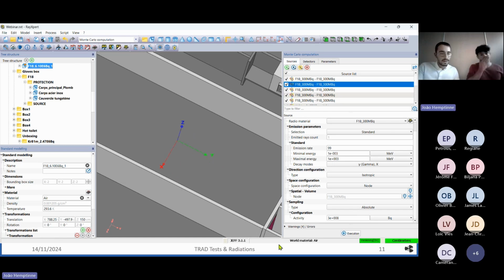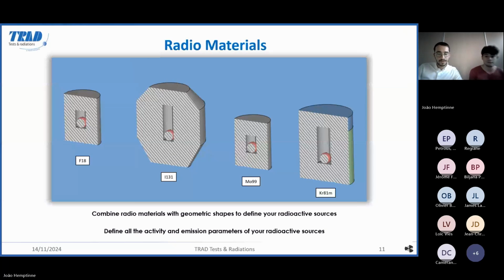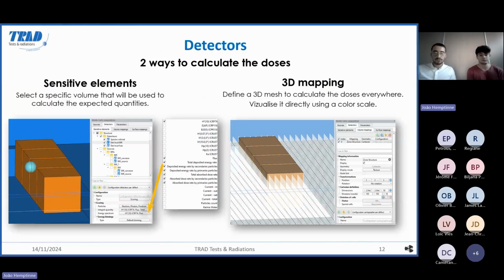Thank you, Leo. Now, if I go back to my slides here, the following point is that when you have your model and your sources, you want to start your calculation. You have two ways to parameter it. The first is you can create what we call a sensitive element. Here, the example can be quite clear. You have a sphere that is a sensitive element. This sphere is made of water and can easily represent the head of somebody.